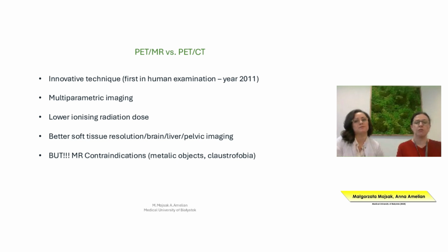So there will be different groups of specialists who should create some key criteria for the specific areas, and definitely PET-MR is of greater value than PET-CT. So it had to be decided which technique will provide which aspects.